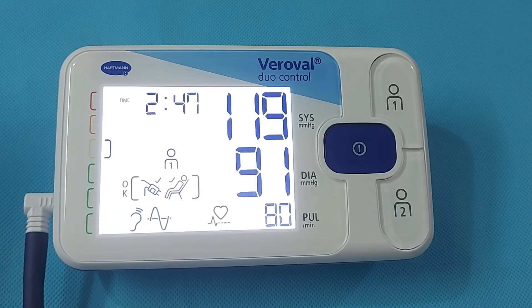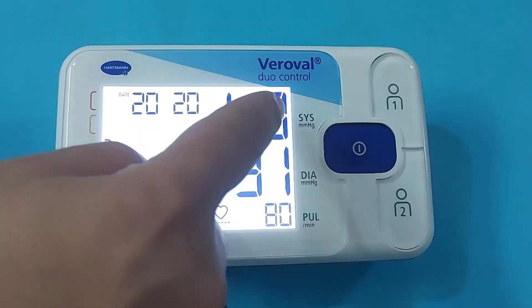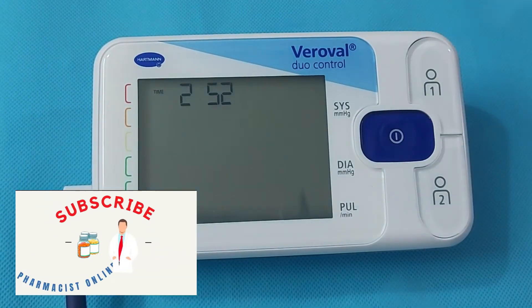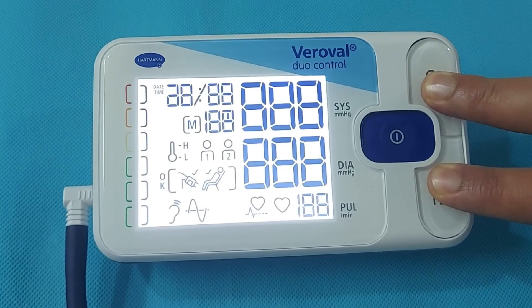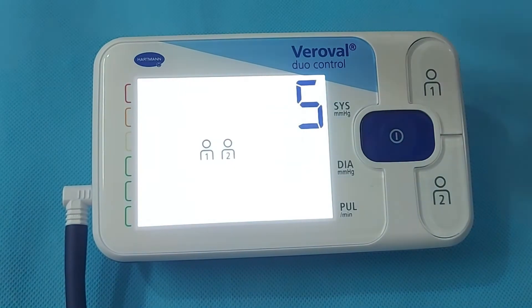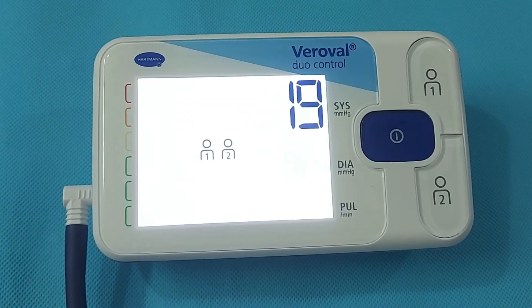The blood pressure readings are displayed in systolic, diastolic, and pulse rate. If you want to check your guest's blood pressure but do not want to keep the readings on the monitor, hold both User 1 and User 2 buttons simultaneously for a few seconds. Both User 1 and User 2 signs will appear on the screen and blood pressure measurement will begin.